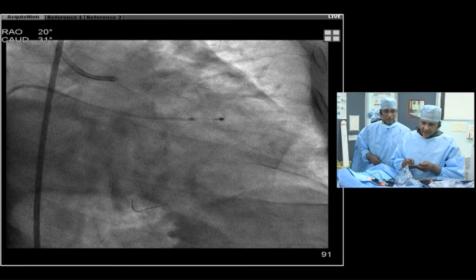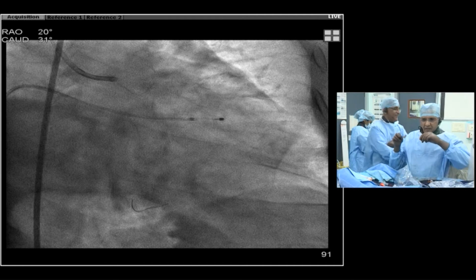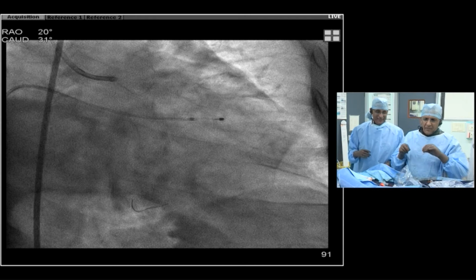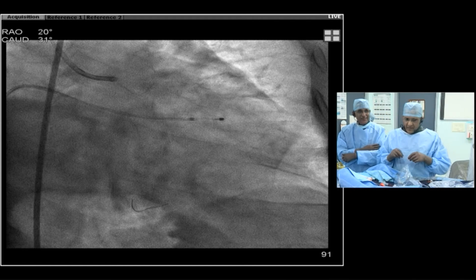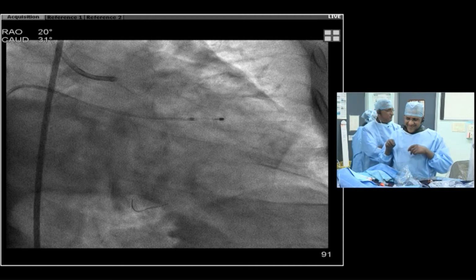I just keep my... You can tell I'm getting old because it's taking longer to thread this. All of us are. Is that a problem you face as well, Ajay? But you have fellows, isn't it? No, but I resolved that problem by progressively keeping more light on the table and wearing glasses. Much better now.